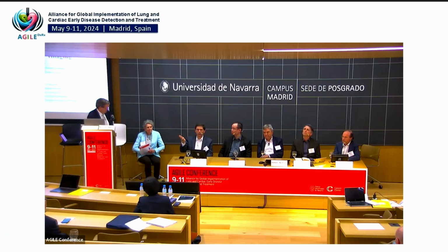And so what we wind up doing is creating a protocol that's somewhere in between. Basically, we'll get the highest resolution we can, and then we'll process the data. You'll create 3 millimeter slices, or 2 millimeter slices, to do emphysema measurement.